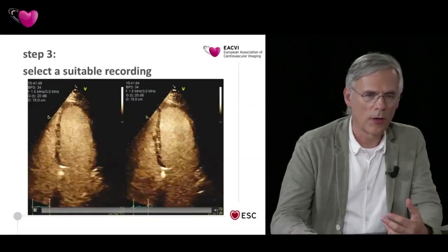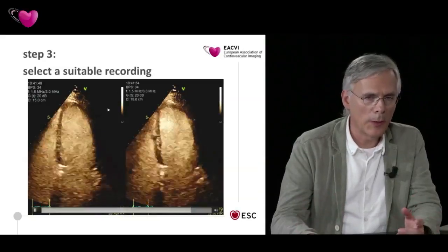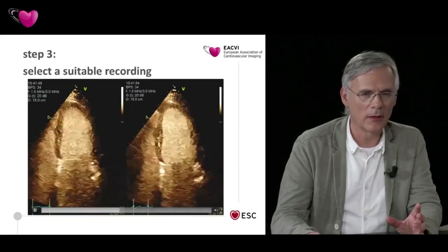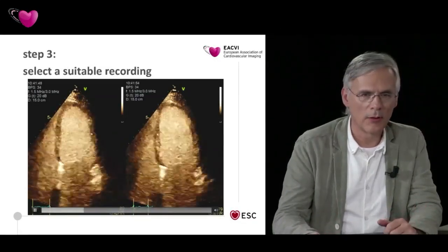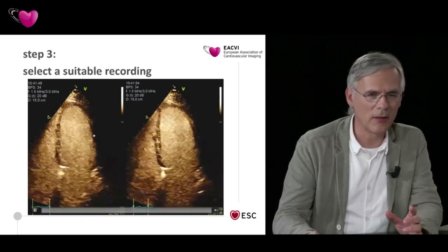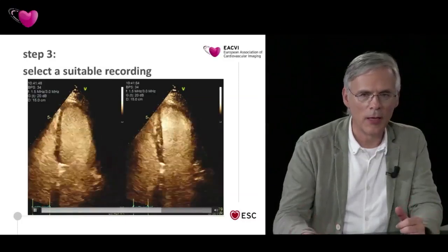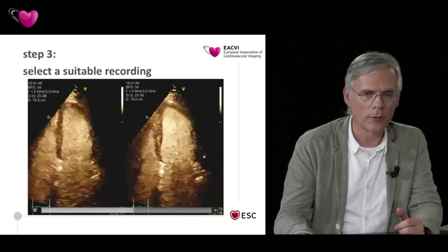Because first of all, there is a homogeneous contrast in the cavity. This is okay. Transmit power, yes, it's okay. There's a little bit of destruction in the apex. We have a good signal here. We can really localize the mitral valve ring, perfect. But what is a little bit unsatisfying is that here there is an interference of maybe a part of the papillary muscle or a trabeculation. And I think it is better to delineate the border or define the border here in this.